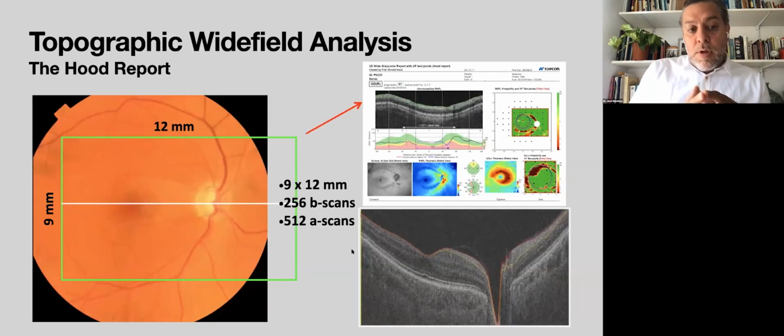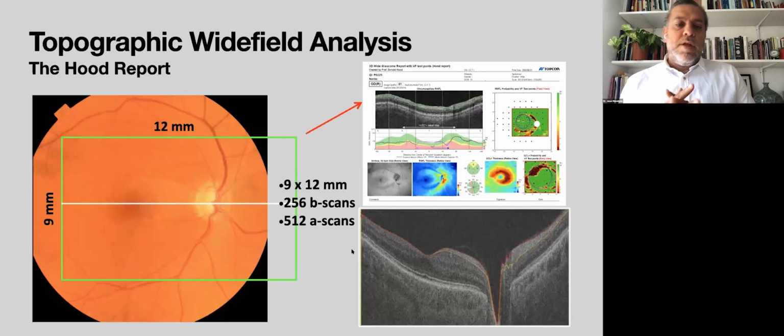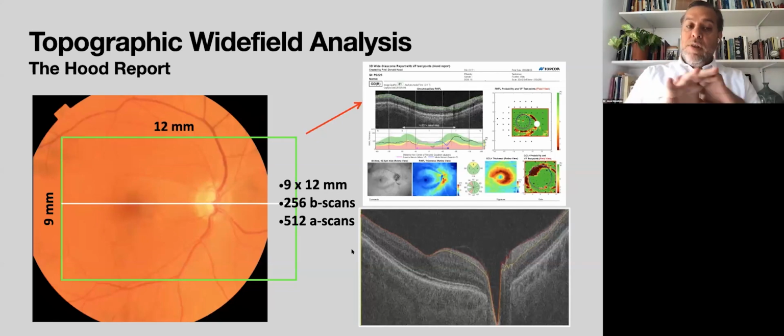With this, we now know that we do have to scan the optic disc, RNFL thickness, and scan the macula. The classic approach for this is doing a 9x9 or 6x6 scan on the macula and another 6x6 scan on the optic disc. You'll have two separate scans. There is software right now from different brands of machines that could stitch this together, and then you'll have a bigger scan. Others are still working with them separately.